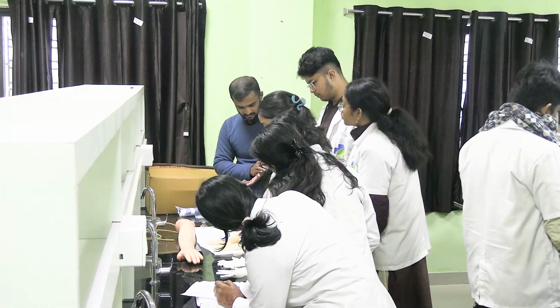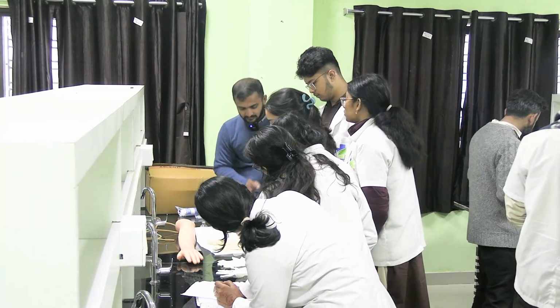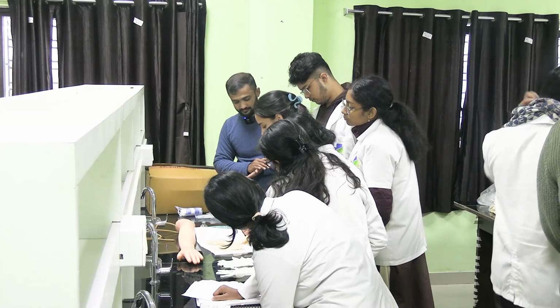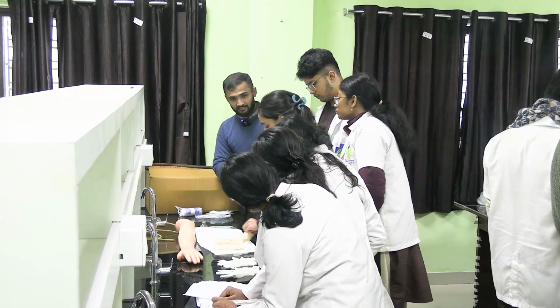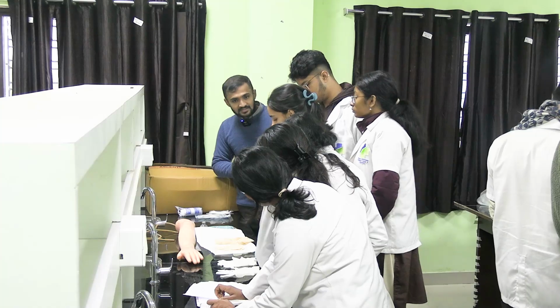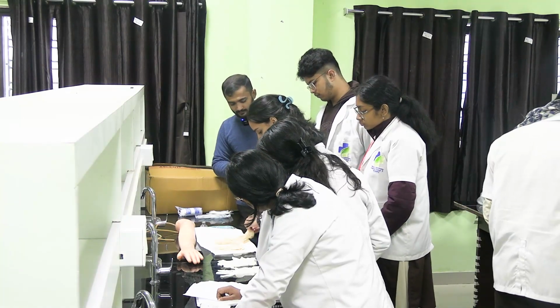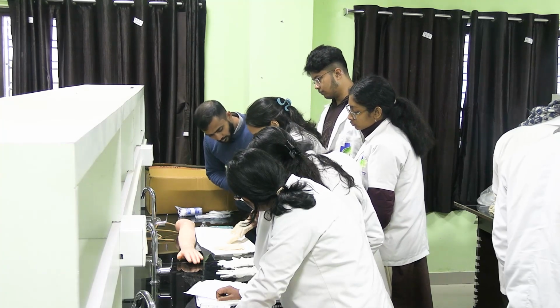I think you have touched the outer part. First, which hand will you introduce? The dominant hand. How will you introduce? Before introducing, one more thing: you should always remove your jewelry and ornaments. Why? Because it might not be properly sterile, and there is also a chance of tearing the gloves. Go slowly.